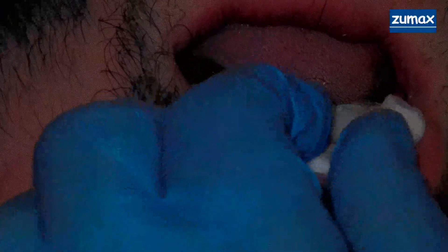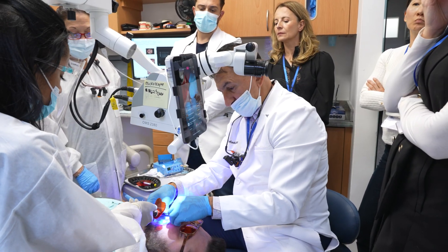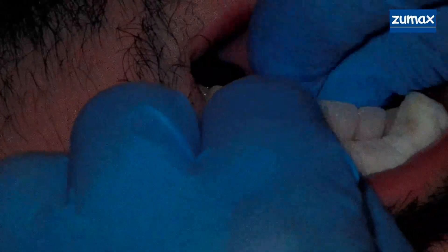There it is — big strip here. One more time there.